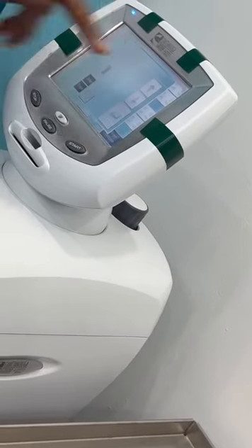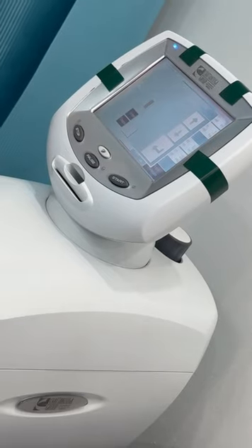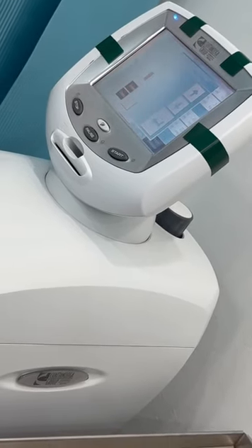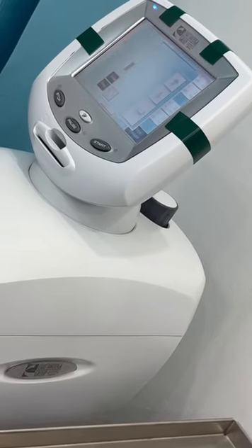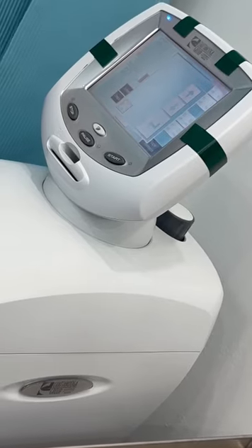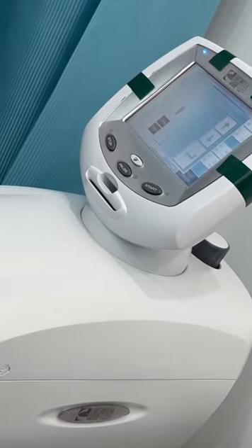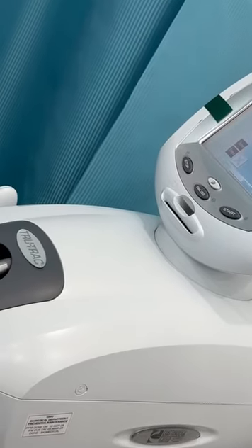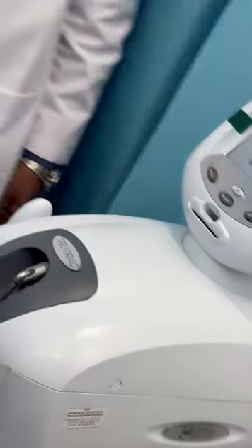Even for lumbar, we can keep the minimum at 0, but clinically, if you think about it, you want to maintain some traction force. For example, you keep 25%, so you start at 25%. For a 100 kg person, you are keeping 25 kg. The minimum traction force you can keep is almost 15 kg, so the 15 kg force will be there continuously.